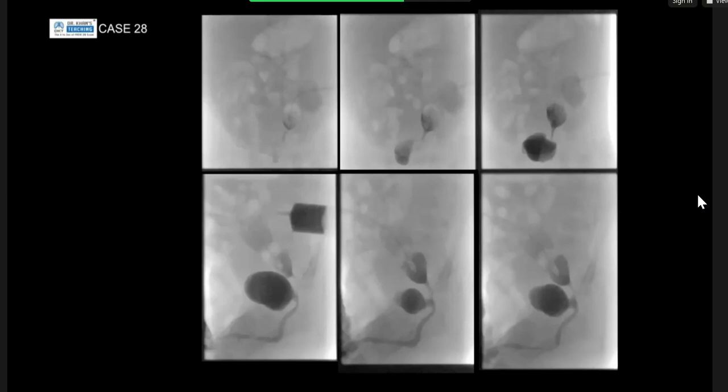Okay, so what we've done on these images is something called a distal loopogram. With the anorectal malformation children, what happens is that they get defunctioned because they don't have a way to pass their feces. So they get a stoma made, and then they have a distal mucus fistula, which is normally quite low in the region of the rectum or the sigmoid colon. And what we've done here is we've put the catheter through into that distal part of the defunctioned bowel, and we're injecting contrast through. And the reason the bladder is being opacified at the same time is because, as candidate 4 said, we've got a colovesical fistula.